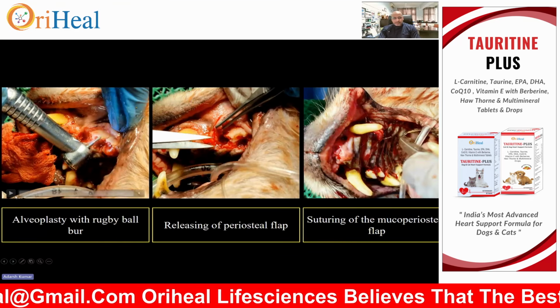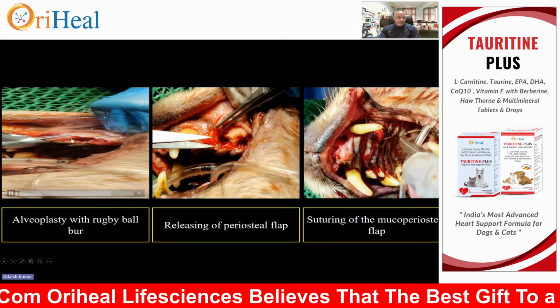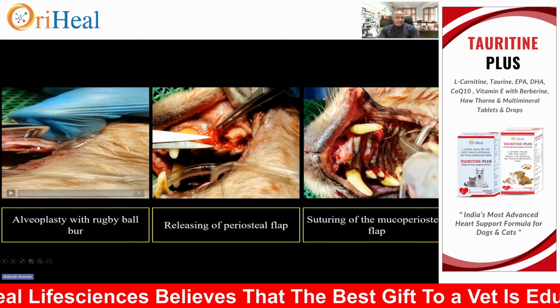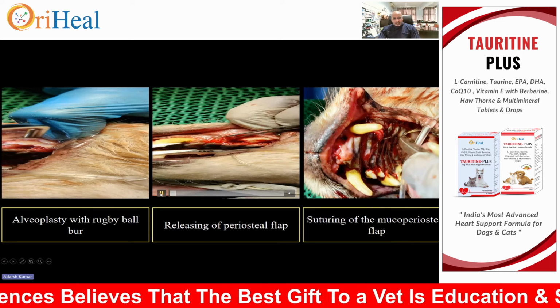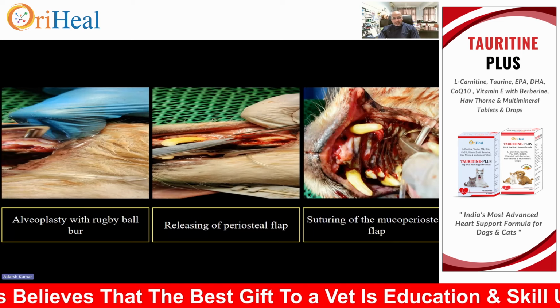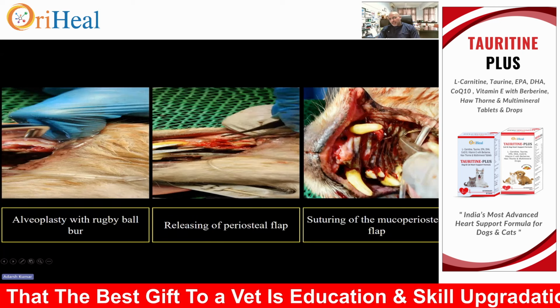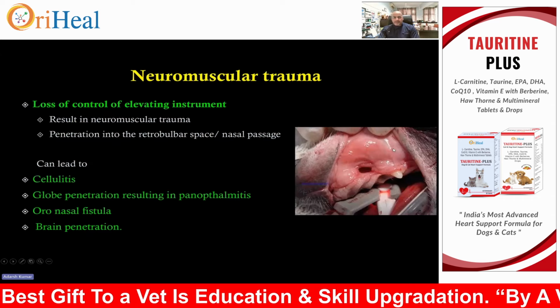Then alveoloplasty. Now this is the alveoloplasty we are doing here to smoothen the edges of the alveola, right? Then release the periosteal flap here slightly, undermine it, and then it is being sutured here. Can you see the sutures here?